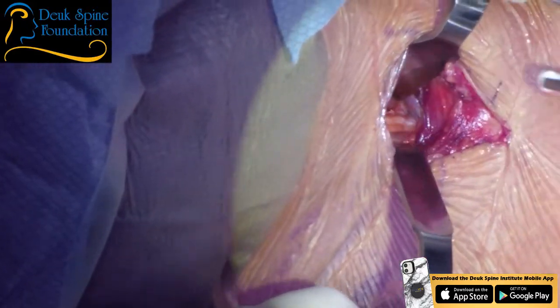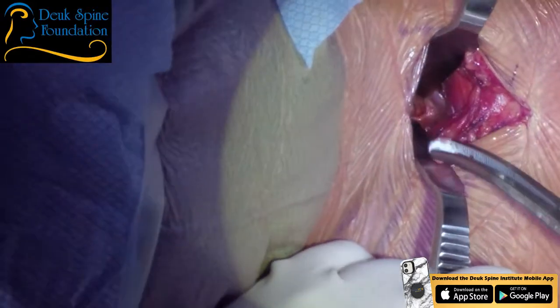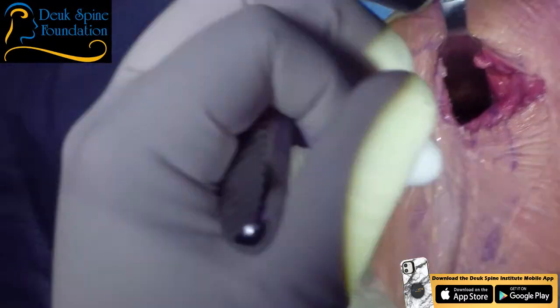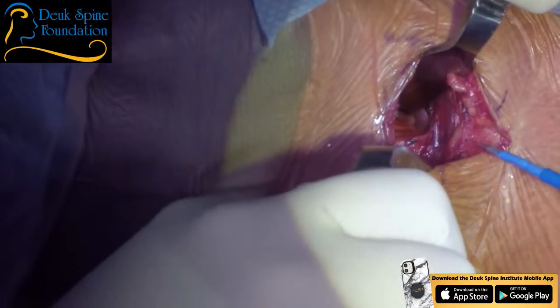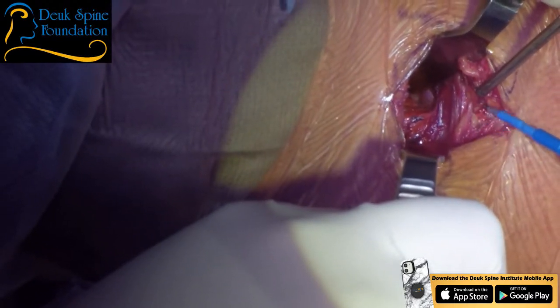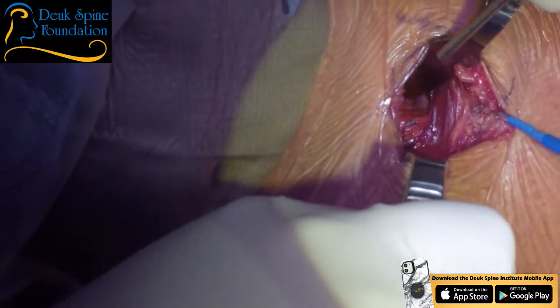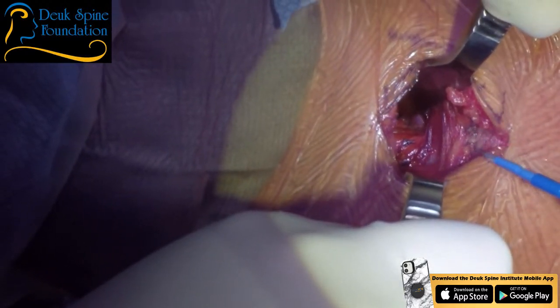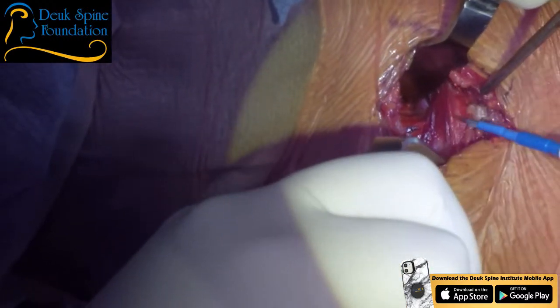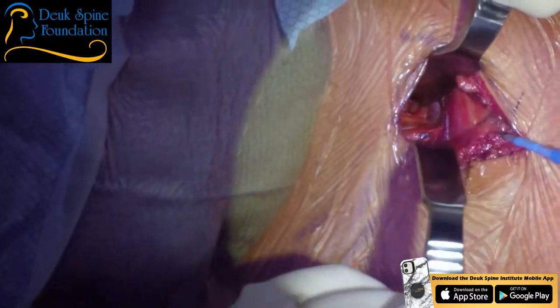I'm using a technique of blunt dissection. That's the carotid artery right there. All right. Dr. Patel? You didn't know you were signing up for a difficult case, did you, this morning when you woke up? Yeah, you're so easy. Don't say that. No, this is honestly a very difficult case. Easy would be a nice skinny little lady, right? Skinny necks are always easier to deal with. So that's your omohyoid muscle right there. Again, we're not cutting it.